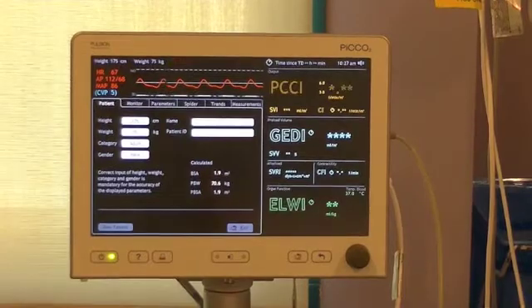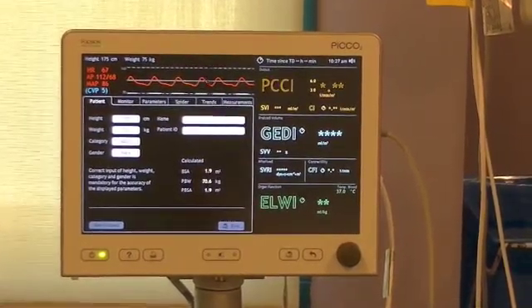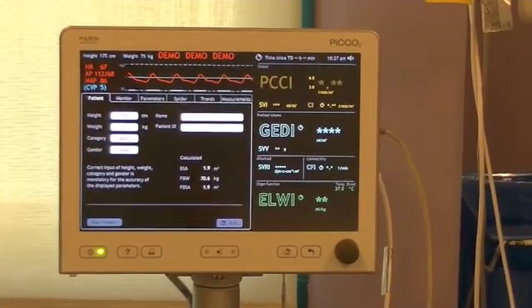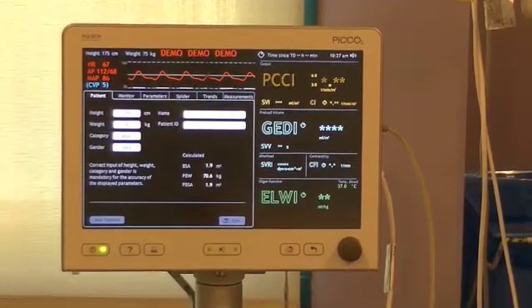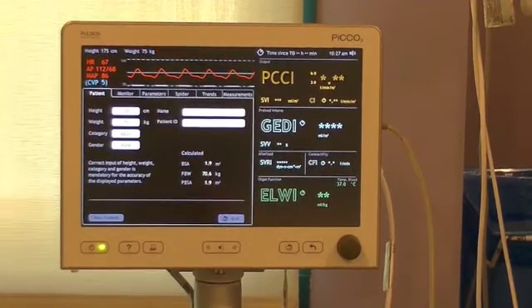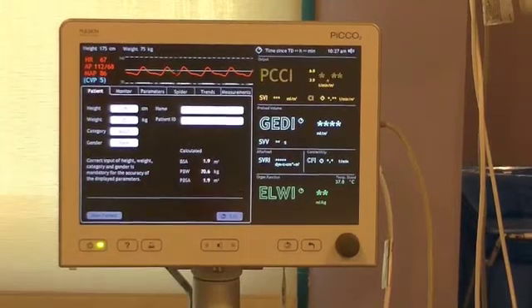It provides information such as continuous cardiac output, volumetric preload and afterload, contractility, volume responsiveness, and pulmonary edema or lung water. This video will not discuss detailed information about what PiCO can do and its indications. What will be discussed are the supplies needed for monitoring and how to initially set up to begin hemodynamic monitoring.